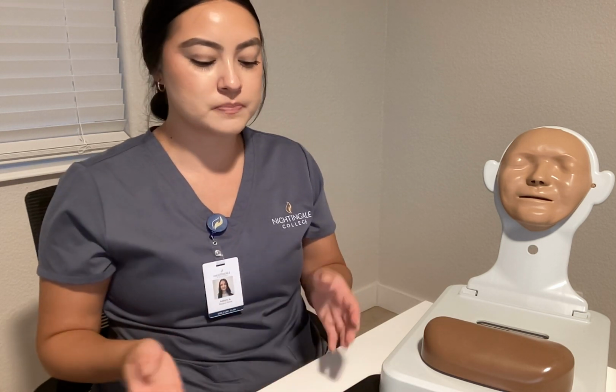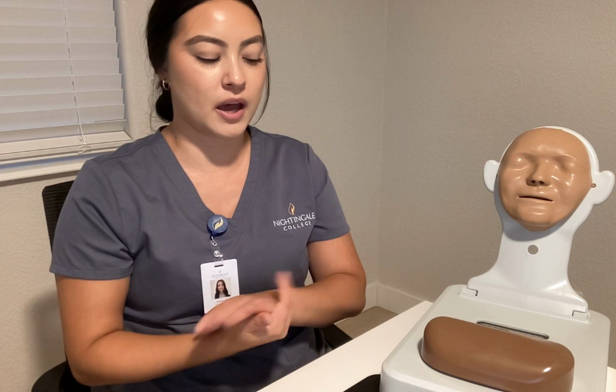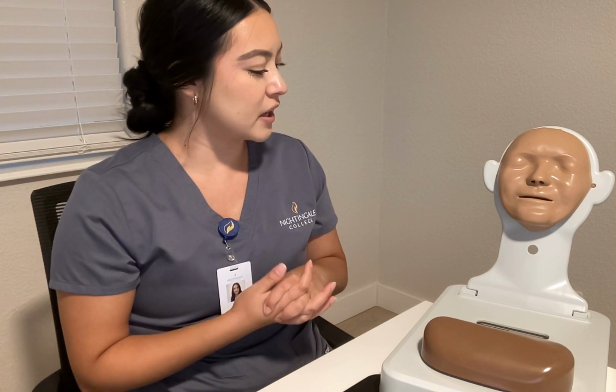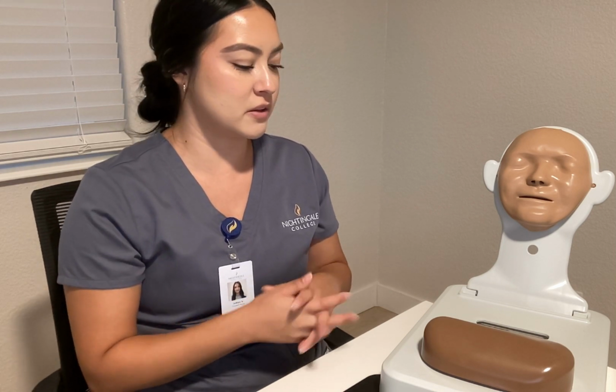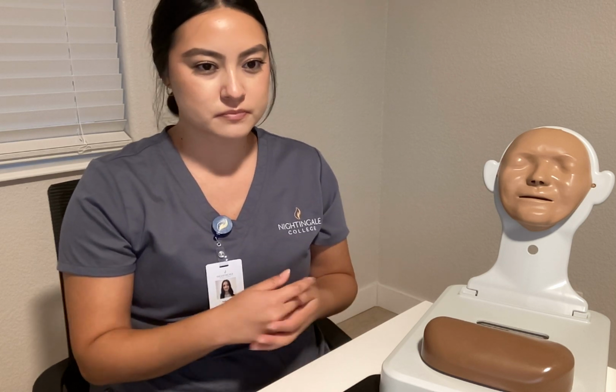So next, after we have our supplies, we'll go ahead and go into the patient room. We enter the patient room, close the privacy curtains, provide hand hygiene. Hello, Mr. Smith. My name is Ashlyn. I'll be your nurse today. Can you please go ahead and confirm your name and date of birth? Perfect, thank you. And then I will go ahead and verify with his wristband.